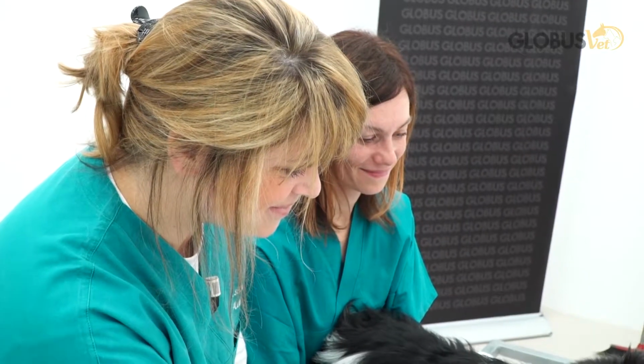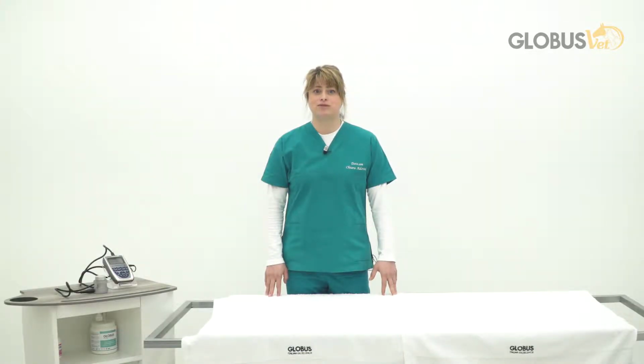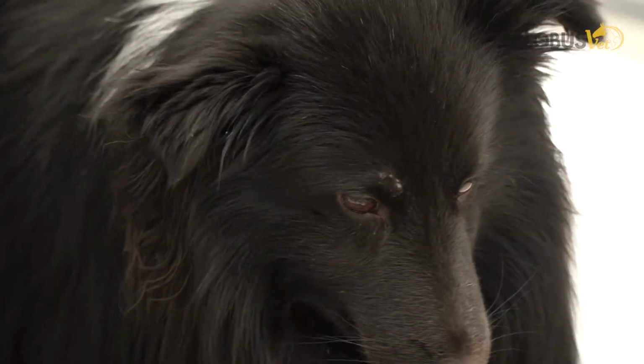The thermal effect of therapeutic ultrasound increases the temperature of tissue, thus giving an increase in blood flow and oxygen to the affected area. Moreover, the heat that is generated increases joint mobility and collagen elasticity, and is able to reduce muscle contracture. Ultrasound helps regenerate tendons and reduce thickening of scar tissue.